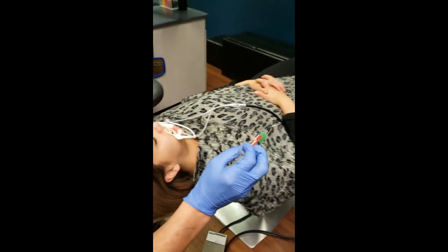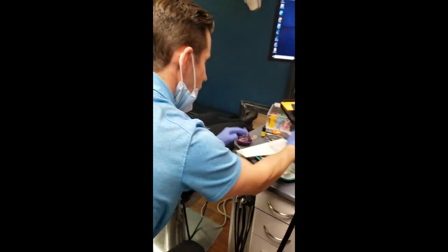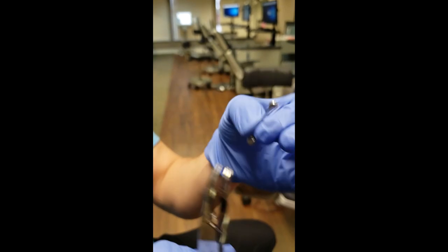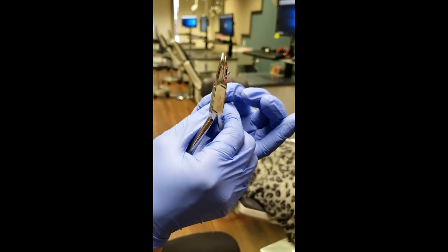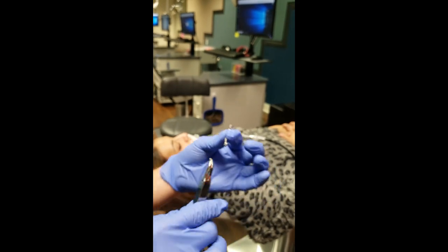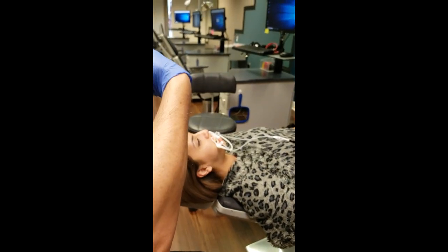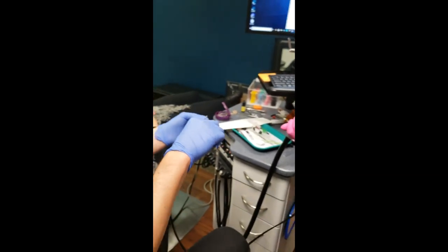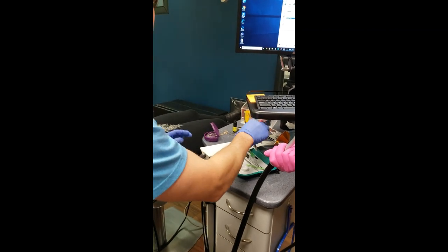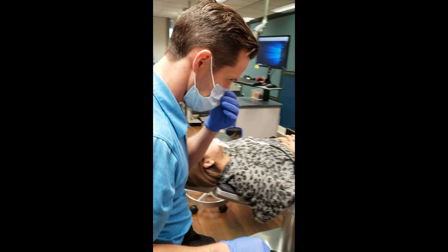The important thing is the buccal part of these. While the etch is sitting, let me show you this appliance a bit more. There's a hook on the right side where the rubber band is going to attach. There's a little dot right there - that dot should go directly into the buccal groove where we measured. It doesn't matter as much where the front part lands on the canine; the dot in the buccal groove is what's critical. You can see how this rotates - that has a function to rotate the tooth around, so the molar is what matters; the canine we can give or take a millimeter.